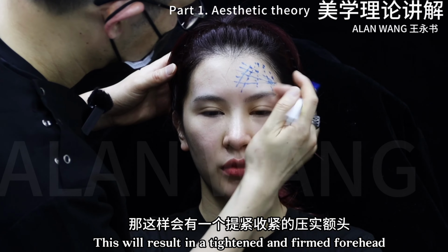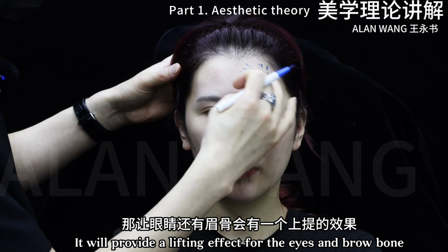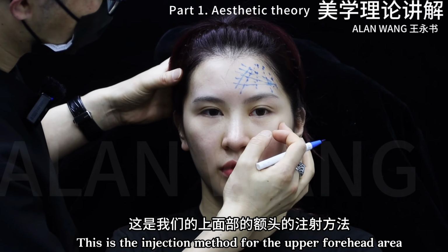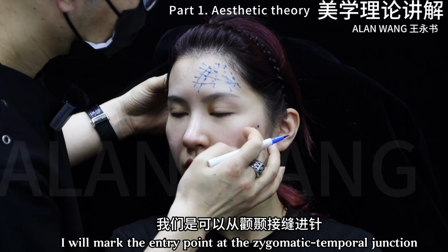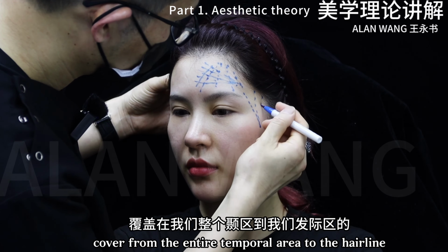This will result in a tightened and firmed forehead. It will provide a lifting effect for the eyes and the brow bone. This is the injection method for the upper forehead area. Next, we will focus on the lateral temporal area. I will mark the entry point at the zygomatic temporal junction. Cover from the entire temporal area to the hairline.